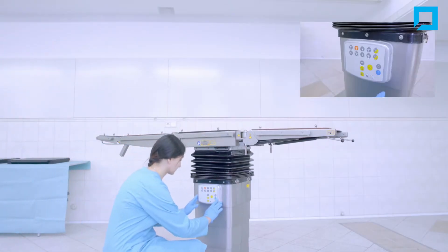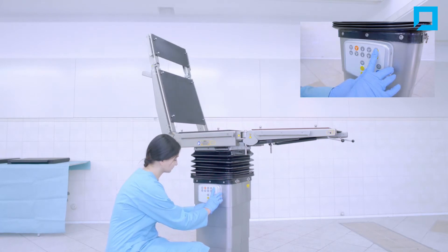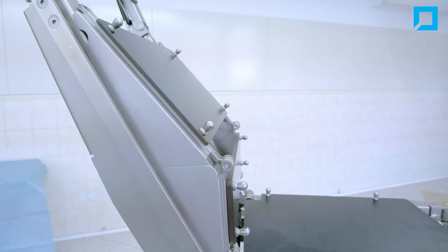Lift the table to the highest possible position. Set the backrest segment to the upper position. If the table has a kidney bench, raise it.